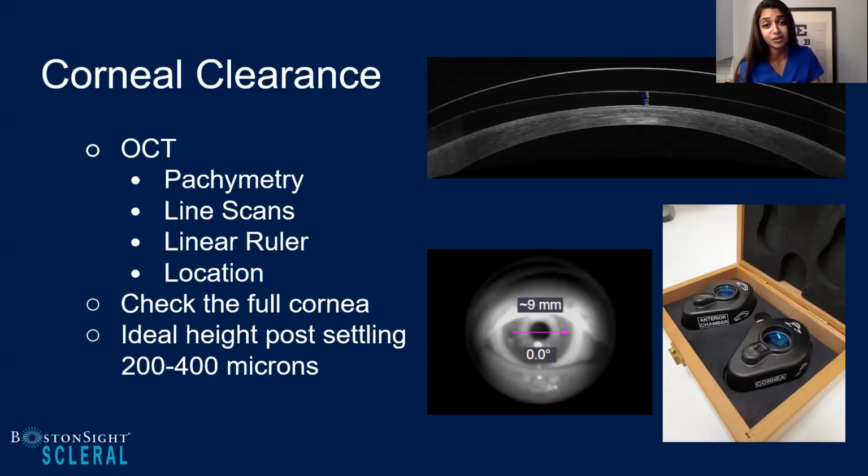So to answer that question, what I'm looking at is maintaining a nice, even, but low tear meniscus height to optimize oxygen. And it really just depends on the cornea. A cone is going to look very different than a regular, dry ocular surface oblate or prolate cornea. So it depends on the eye.